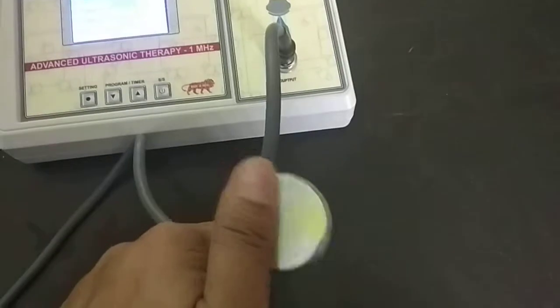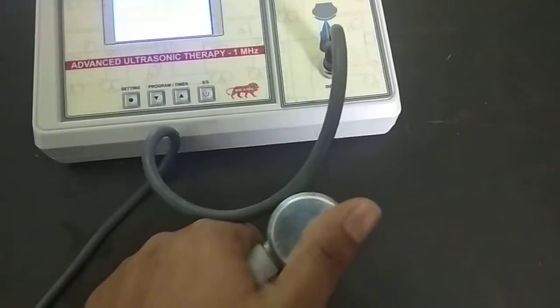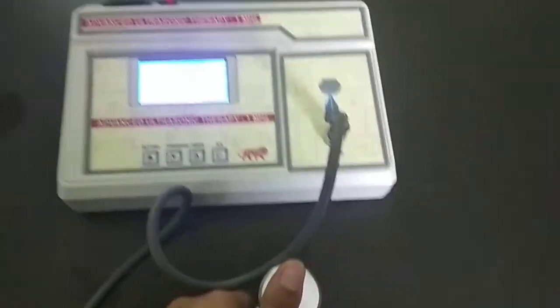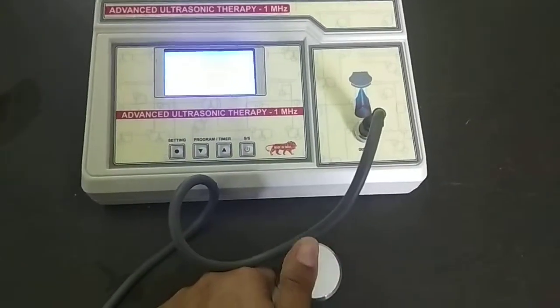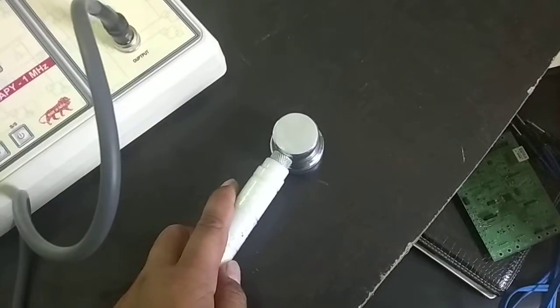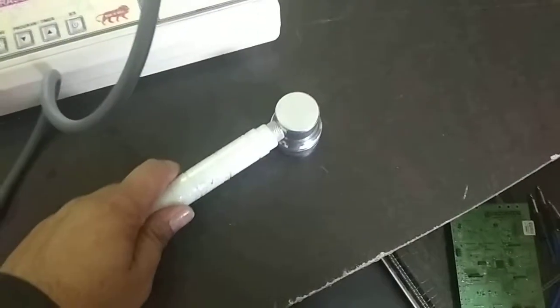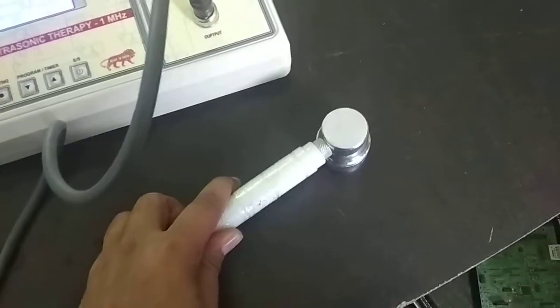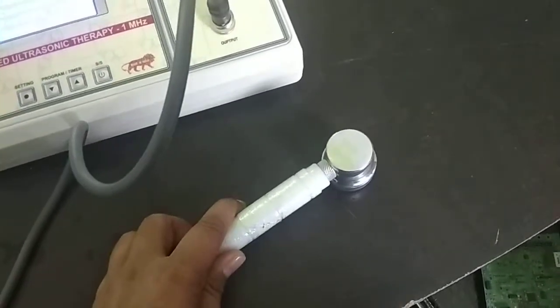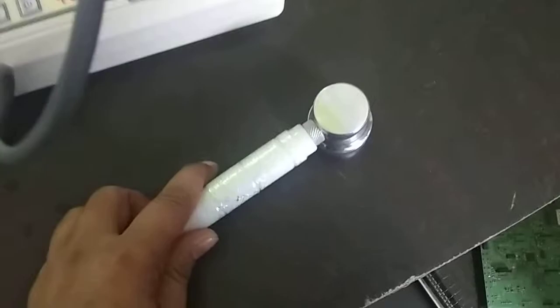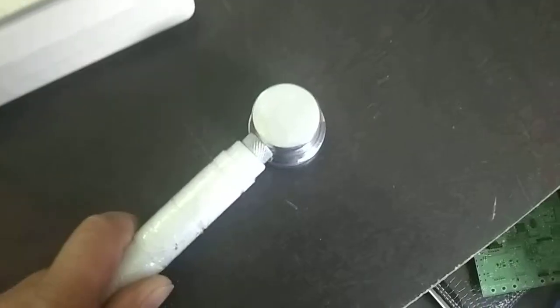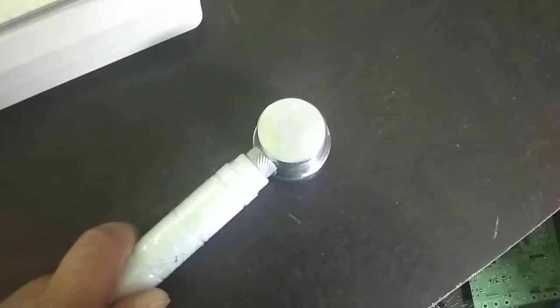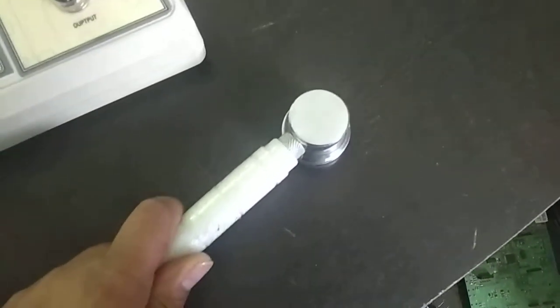Now output is coming. You can place the Output handle like this on the patient's body. You can place it at one place also, but not for maximum time.